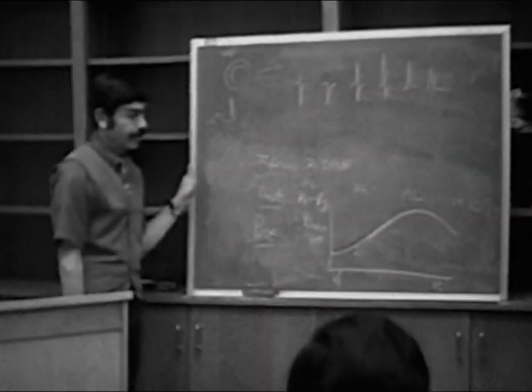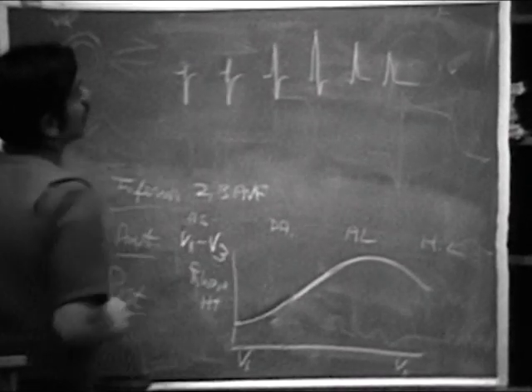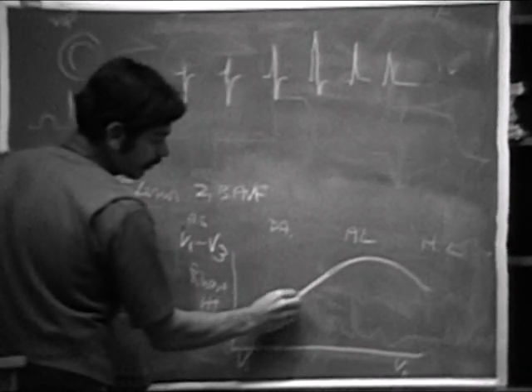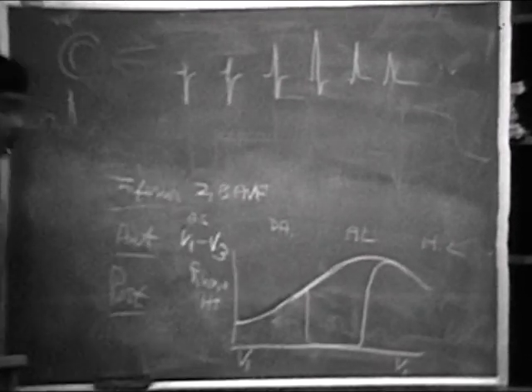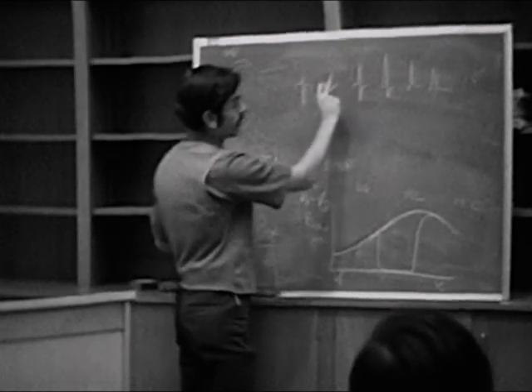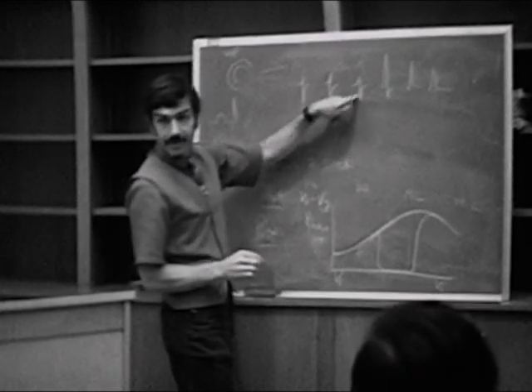Okay, now direct anterior wall MI. You see normal R wave progression proceeding out maybe to around V2 or V3. You have a loss of the R wave progression, and then a return to normal R wave progression. If we were to take a look at our electrocardiogram, we'd see normal R wave progression out to V2. About this point, we may see a loss of the R wave. We may not see a Q wave develop yet.